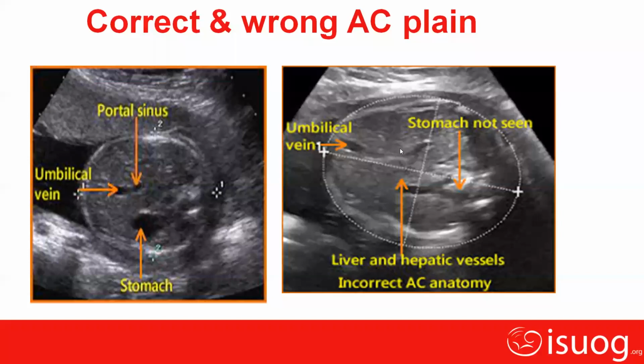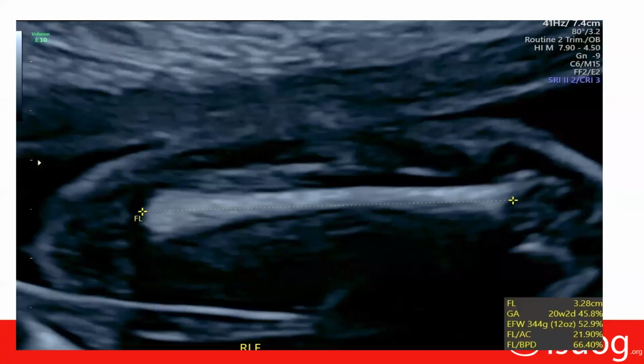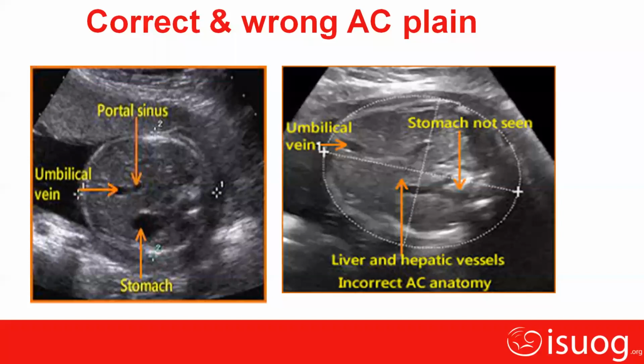Please, everybody, just see next to the crura of the diaphragm: instead of the kidneys, you can see the adrenals, which appear like a rice grain. Just next to the spine, next to the crura of the diaphragm on both sides. The picture is there; instead of where the kidney should be, paraspinally you can see the adrenals, with a rice grain like appearance. Yes, madam. Thank you, madam. Important point, we should note it.